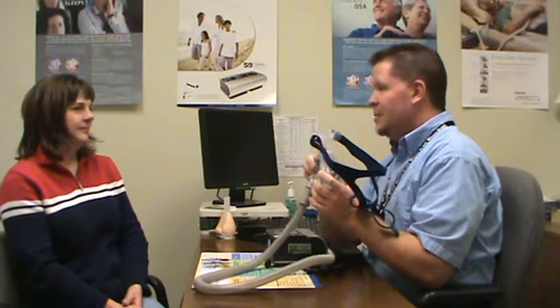The next option is your exhalation port on the front of the mask. There's always going to be air coming from this port. The air's got to go somewhere when you exhale. So don't think you've sprung a leak. There's always air coming from there.